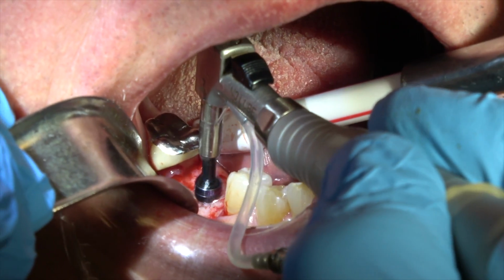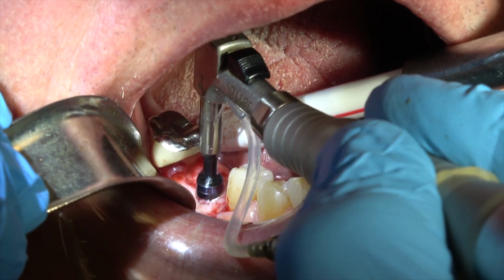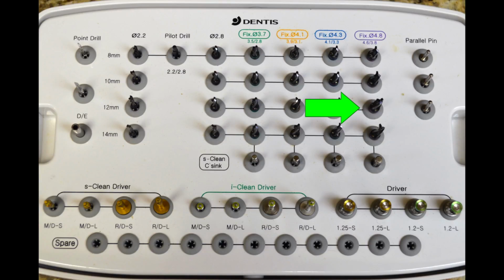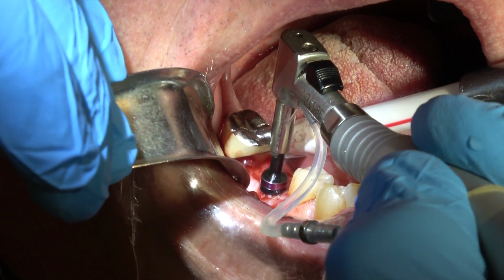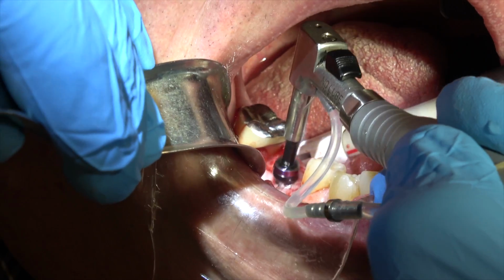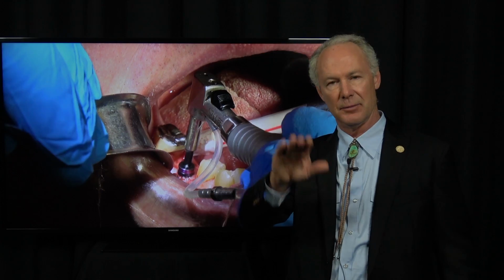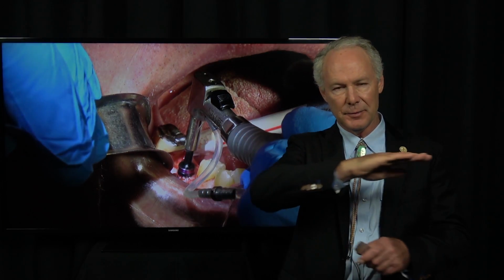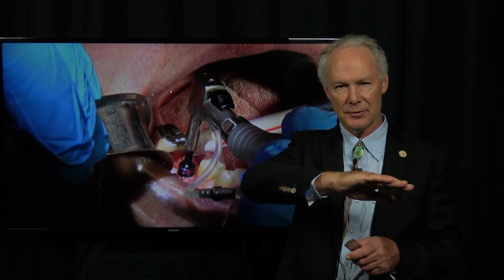So here we go. I've got an extender on here now, so the handpiece doesn't bump the adjacent teeth, and I'm able to use the largest drill. Isn't that amazing? With that platelet-rich fibrin. Now, I personally like to place a collagen resorbable membrane over the platelet-rich fibrin when I'm preserving a socket, just because I've got a flat surface when it heals.